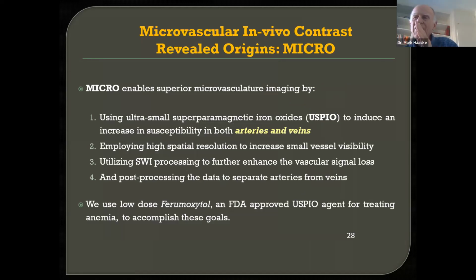The reason we see the veins using SWI is because they have deoxyhemoglobin in them. So when that blood comes in, the tissue eats up a certain amount of oxygen, about 30% of the oxygen. So you have 70% oxygenated blood and 30% deoxygenated blood. And when you take that oxygen away from the hemoglobin, basically you take 2 oxygen atoms away from the iron and you have now unscreened it. And when that iron atom is unscreened, it develops a small paramagnetic susceptibility. And using this technique, SWI, that I developed, we become sensitive to the presence of that deoxyhemoglobin.